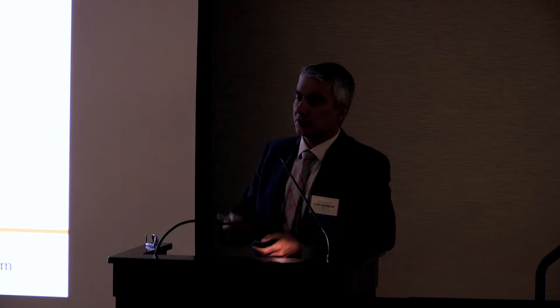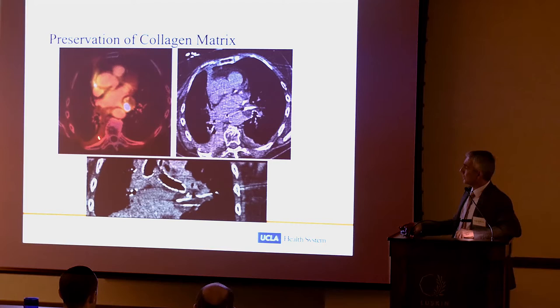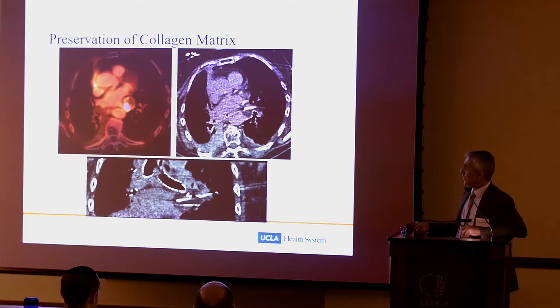Here's a case I did the first time I went to the OR with Dr. Cameron. One of our dear patients had right-sided mesothelioma, resected out, radiated, chemotherapy, and then she had recurrences over the course of many, many years. She would come and we would do ablation, till she developed a recurrence on the contralateral side. One of the things we were worried about is if this tumor continues to grow, it's going to block the left side, which is actually her good lung. So in the operation theater, we went ahead and placed probes inside the tumor, and we ablated it.